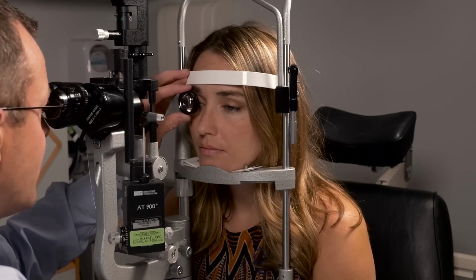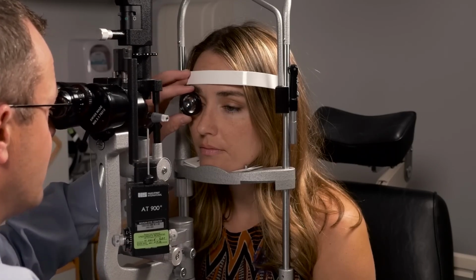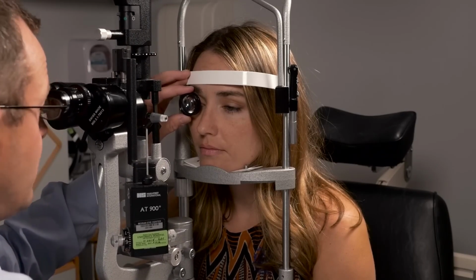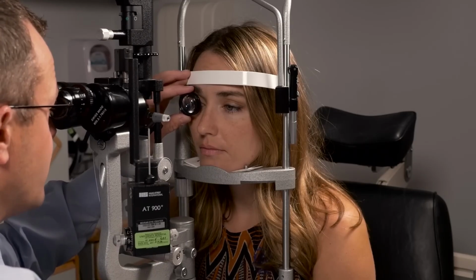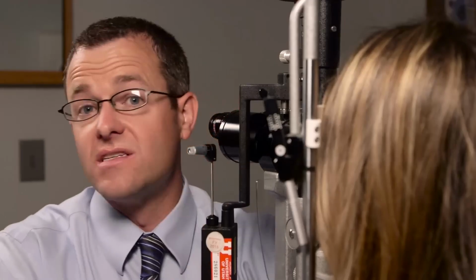And then you'll look in through the slit lamp, and once you find their pupil, you're going to pull back a little bit till you see the orange beam come in focus, okay? When the patient is dilated, it's much easier to do. On a non-dilated patient, it takes a little bit more side to side and up and down movement to be able to get the nerve and the retina and the macula into view and into focus.